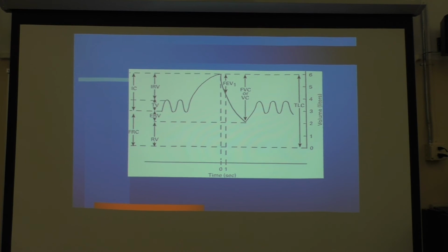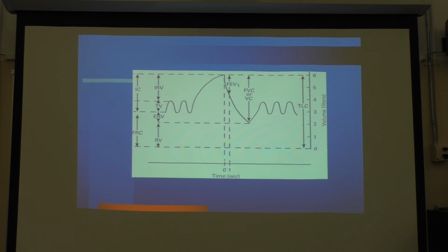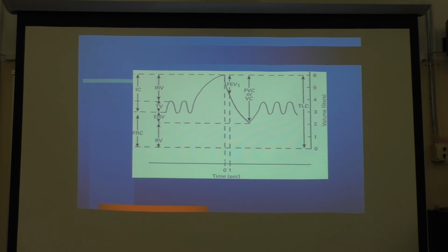This is the output of an FVC test, or forced vital capacity. So this is where we will clinically force out the air. And as you'll see in the upcoming example, an individual breathes into a spirometer with nose clips, so no air escapes, normally until the conditions are right, and the administrator typically puts up a finger, and that person will take a breath in as far as they possibly can go, so getting their IRV, and then they will forcibly expire all of that air, as you can see on that downslope there, until they can no longer expire air.